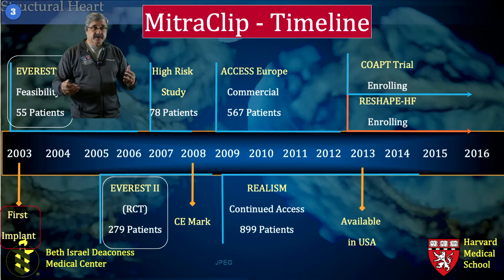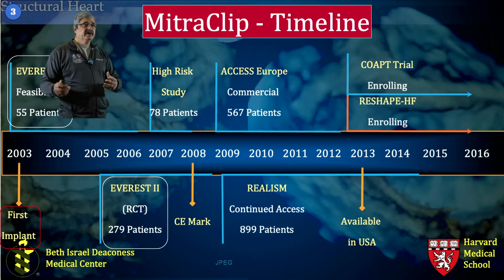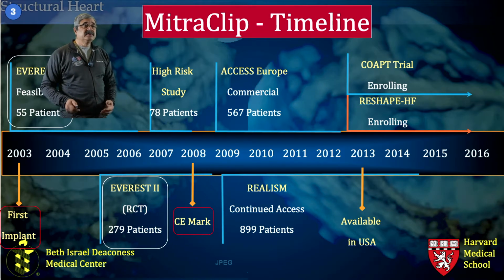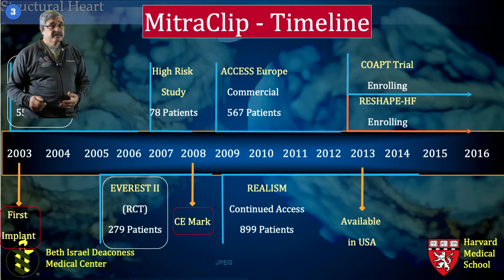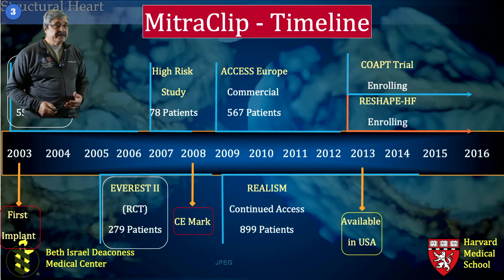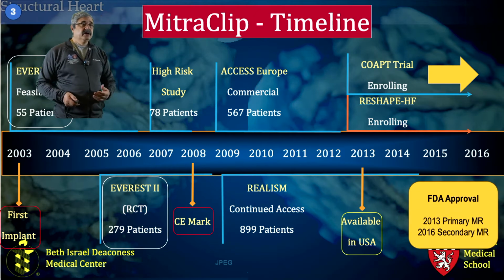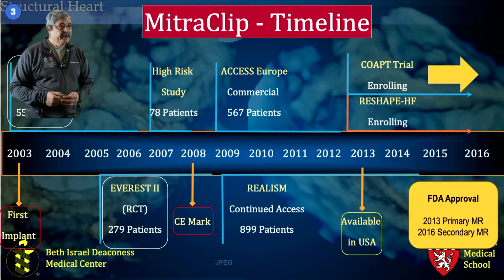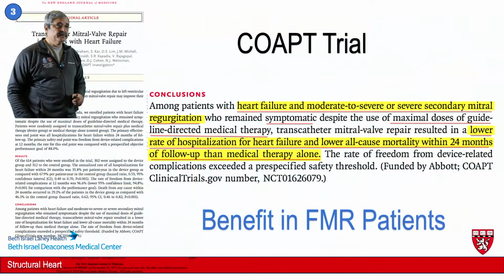So the majority of the recurrences were with MitraClip in the first year. If you go beyond the first year, this demonstrated that it was pretty much as good as surgery. Then there were multiple trials, the high-risk study and the Access Europe study, but all that led to a CE mark, which is kind of the FDA approval in Europe, in 2008, followed by availability in the USA in 2013, and then started the major trial, the COAPT trial, which we'll discuss in just about a second. The device was approved by the FDA in 2013 for primary MR and 2016 for secondary MR.